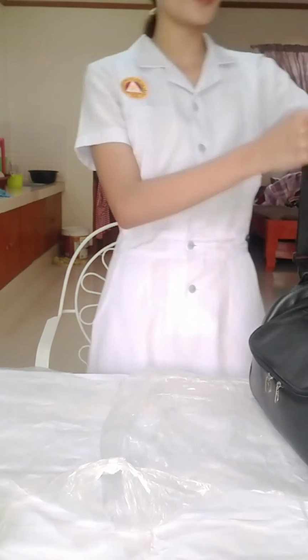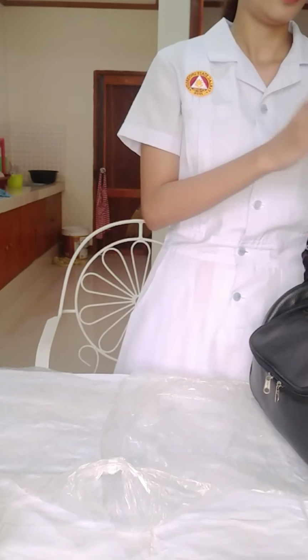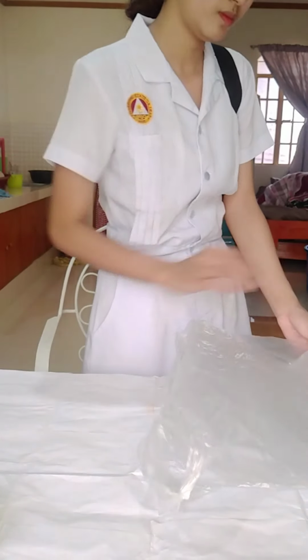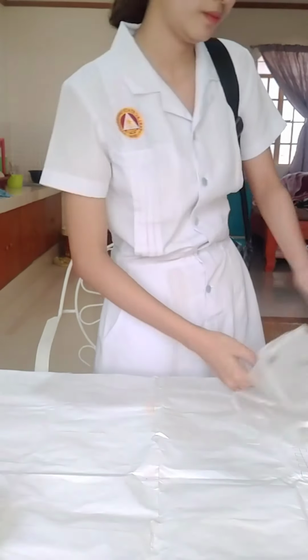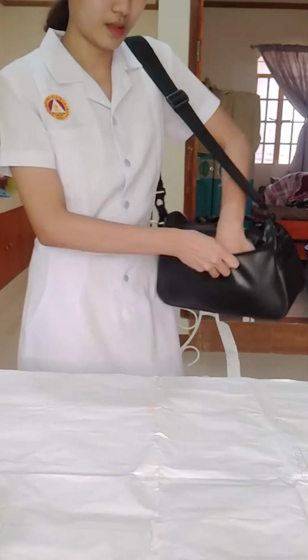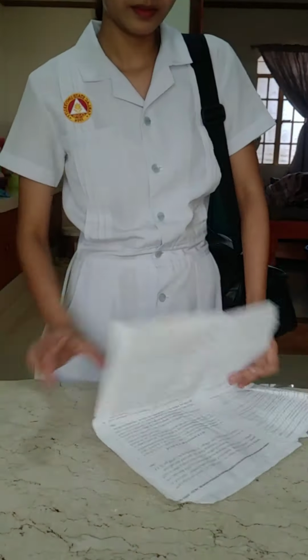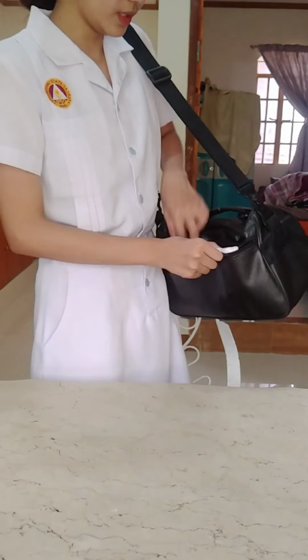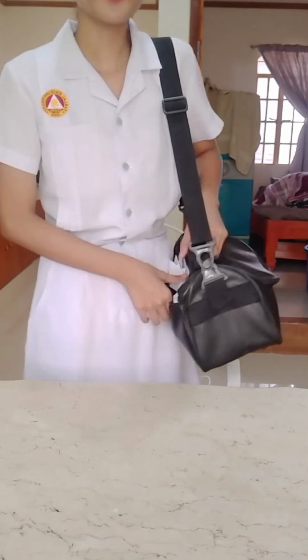And then I'm going to fold my plastic lining and place it in my CHN bag. Assuming that it will fit in my CHN bag. And then close the bag. And then after that, we need to document all the test results. So I'm going to document it.